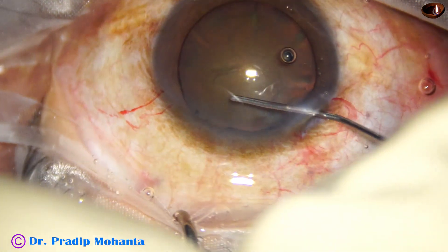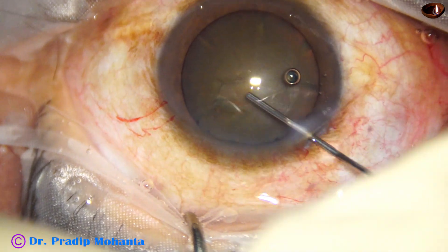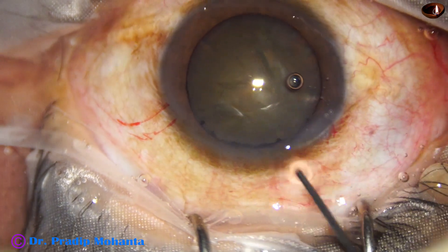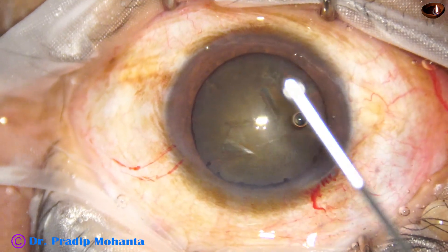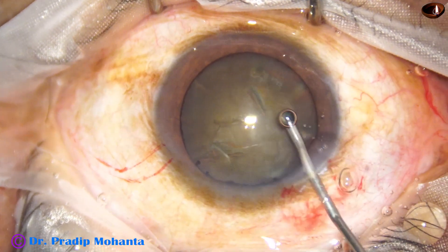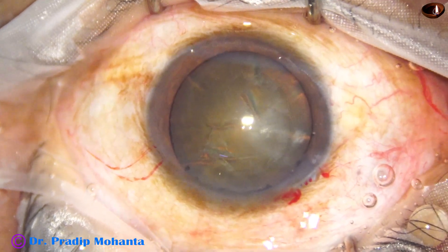Hydrodissection is done with a 27-gauge cannula and BSS. The nucleus is tapped so that the fluid comes out anteriorly along the equator.